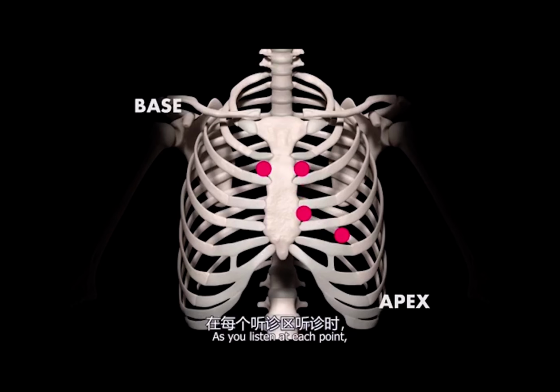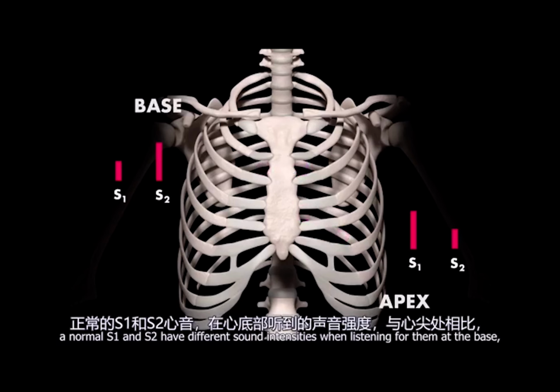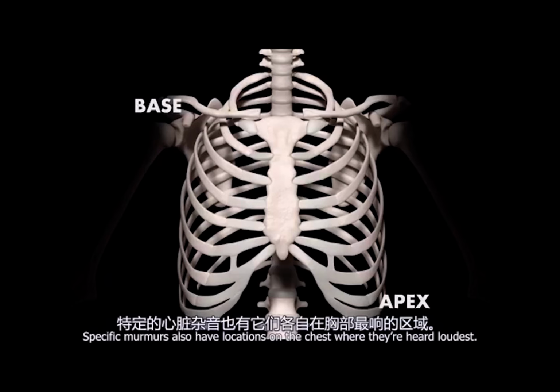As you listen at each point, keep in mind that some sounds are heard better than others at different points. For example, a normal S1 and S2 have different sound intensities when listening for them at the base, compared to the apex. Classically, S1 is usually louder than S2 at the apex, and S2 is usually louder than S1 at the base. Specific murmurs also have locations on the chest where they're heard loudest.